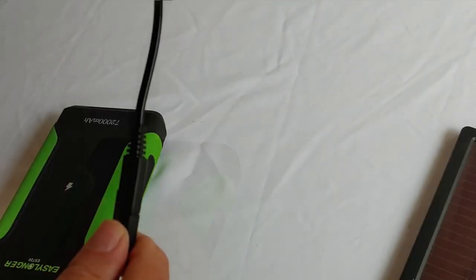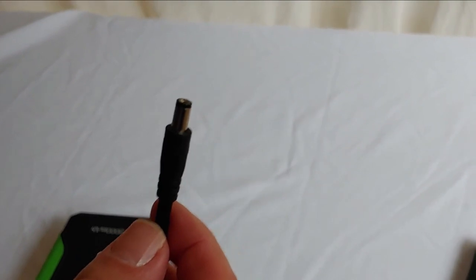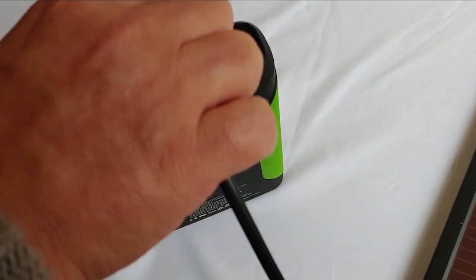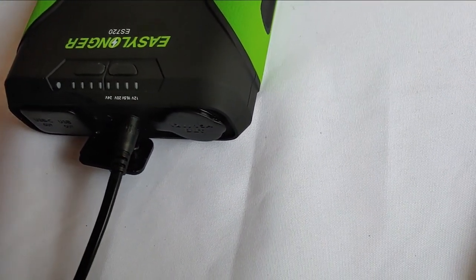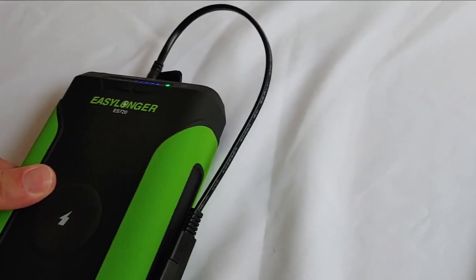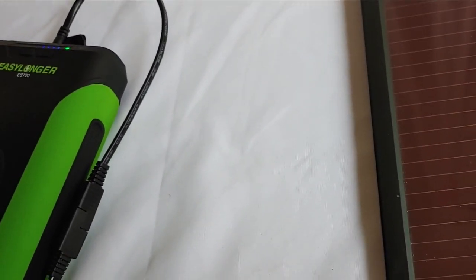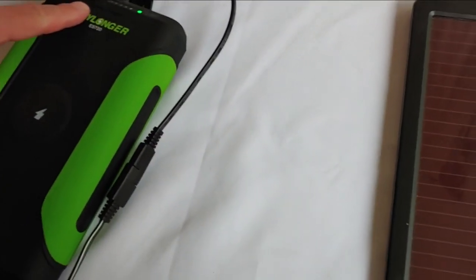And then this connector will connect to our battery backup bank right here. Here is the DC connection — we simply take it, plug it in, and once we get it plugged in, it is now charging. This is going to charge real slow because there isn't a lot of sun on the solar panel and it's a small solar panel, but that's simply how you charge it up.